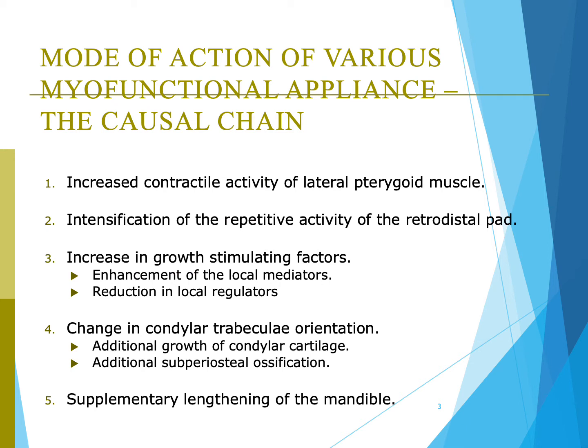So what is the mode of action of various myofunctional appliances? This is what we call the causal chain. What happens is the functional appliances will increase the contractile activity of the lateral pterygoid muscles, and this activity will cause intensification of the repetitive activity of the retrodiscal pad.